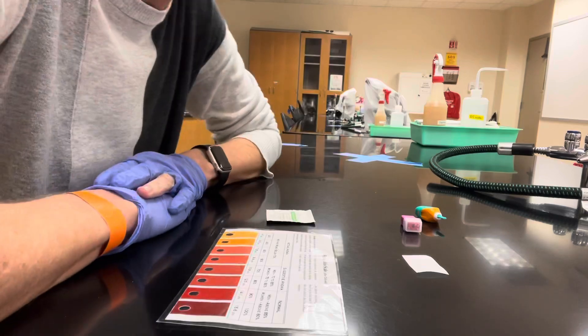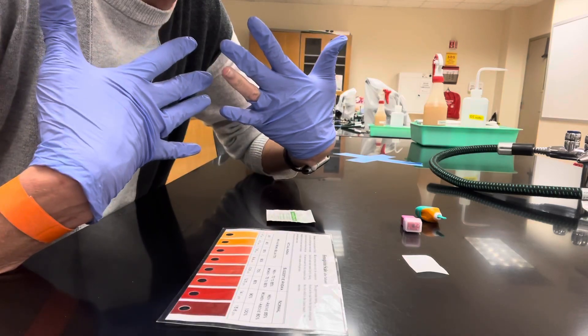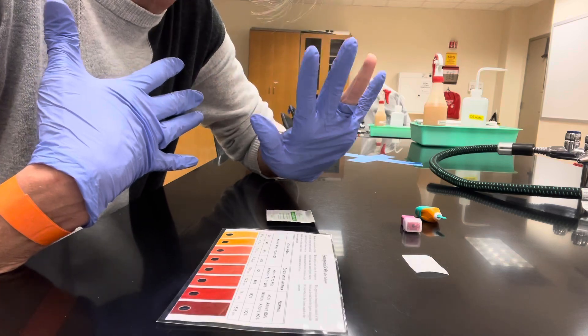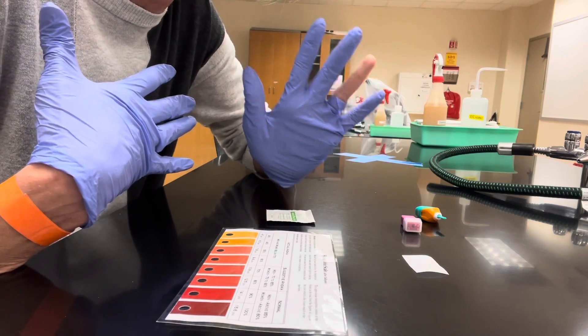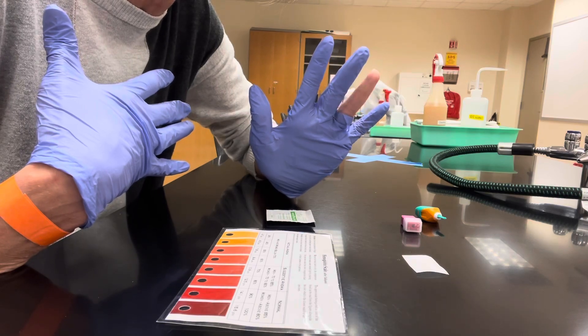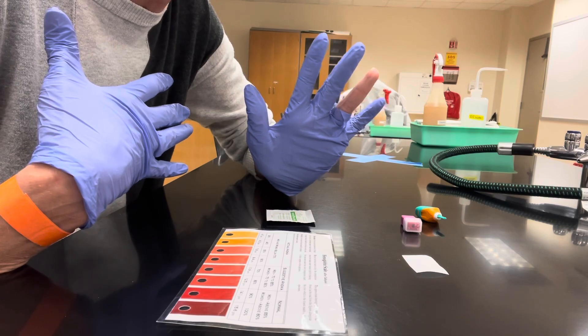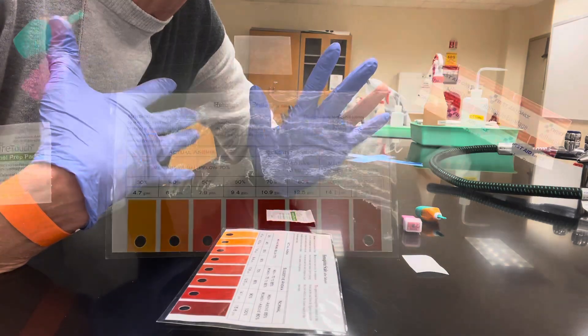Since you are both clinician and patient today, and I know you're wearing gloves, go ahead and rip off the finger on your non-dominant hand of either your third or your fourth phalanx. This is the finger you're going to use to do a puncture to get a drop of blood.